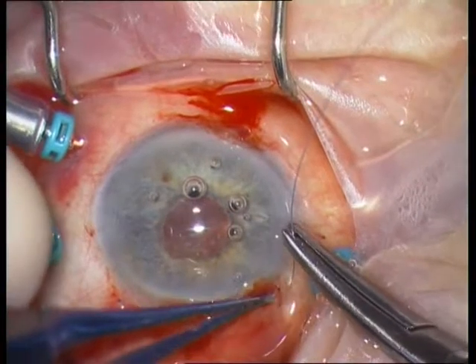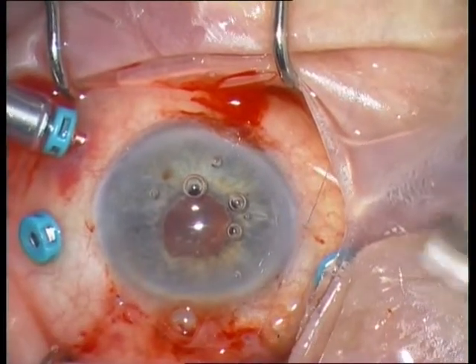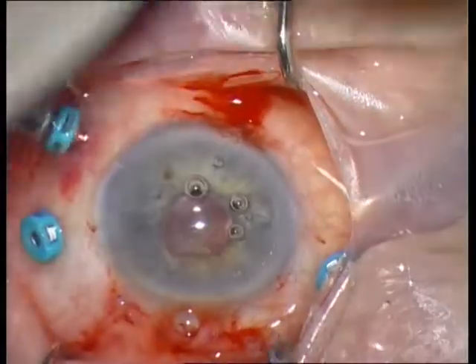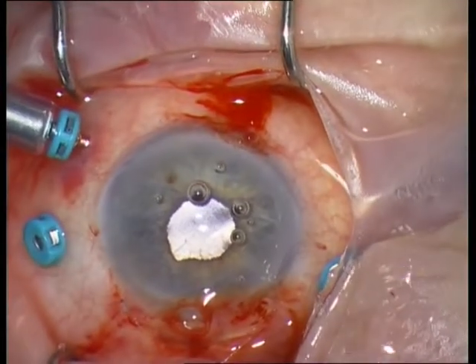The next step is the closure of the conjunctiva with a simple non-interrupted Vicryl 8-0 stitch on both sides.